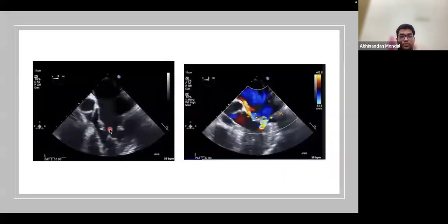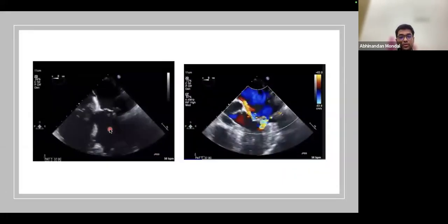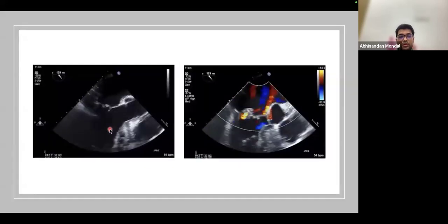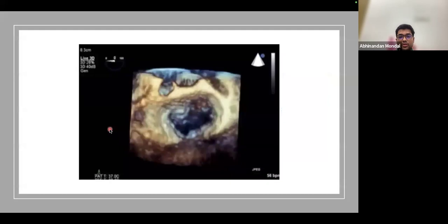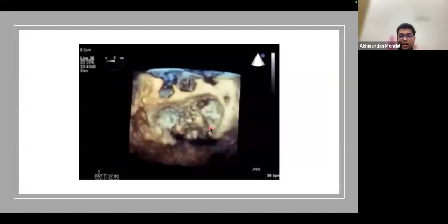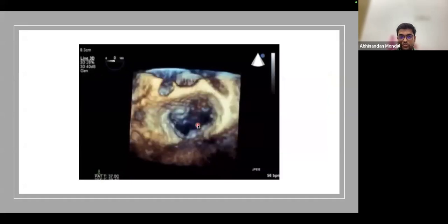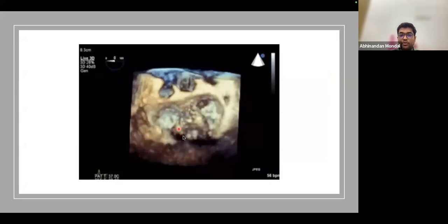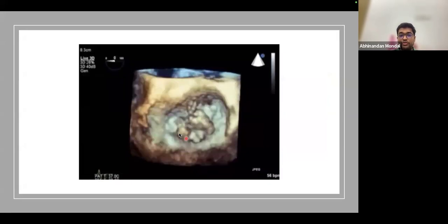Sorry, let me go through. So you can appreciate over here, this is a P1, P1 flail, and also there is a prolapse of your P2, P3 junction.